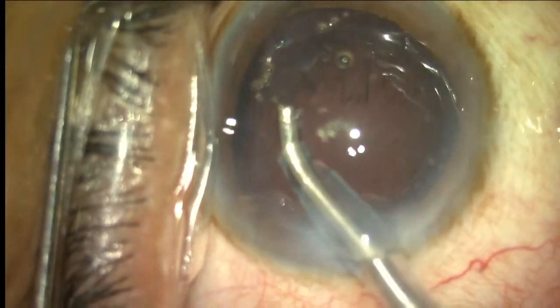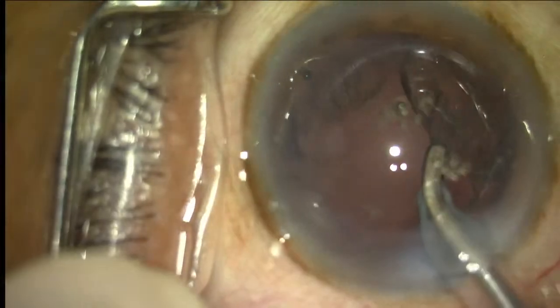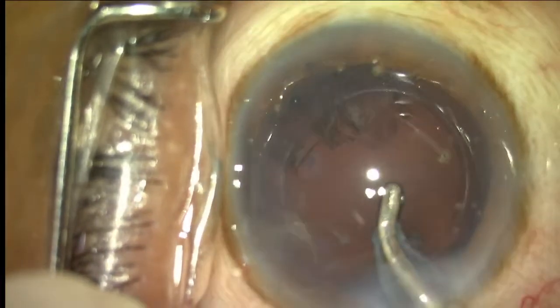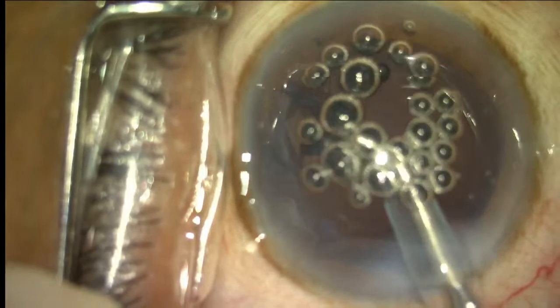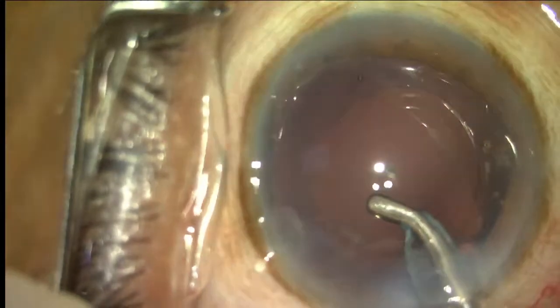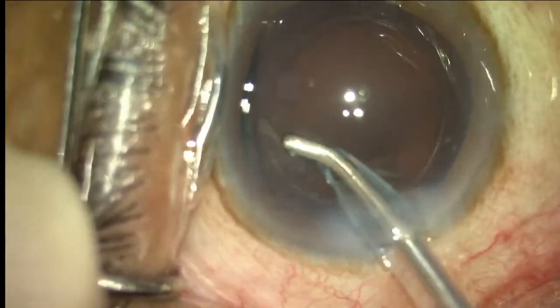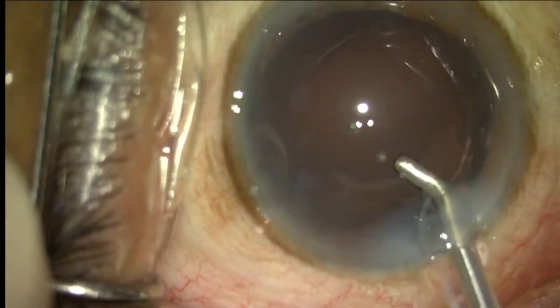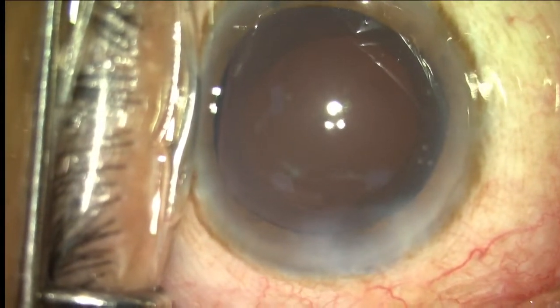So I'm using this IA cannula for... I'll be discussing the technology when I'm implanting the lens. So there's a bit of stringy cortex here. Please give me hydro polishing.